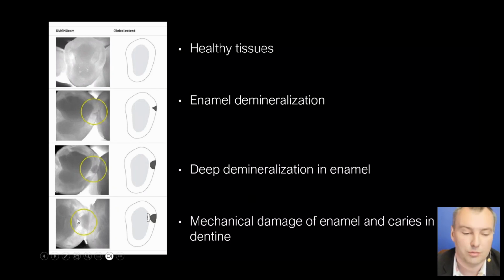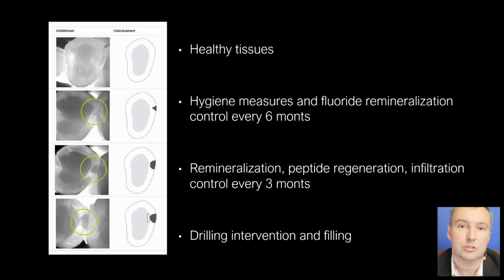Whenever you observe, like in this case, contact with dentinal tissue, then be sure it is actually a deep cavity in the dentin. The dentin is already changed. No doubt about it. Even if you don't see anything with your eyes, even with magnification, sometimes I don't see under the microscope even. Believe me, it is still there. And also this is what tells us about our treatment plan.